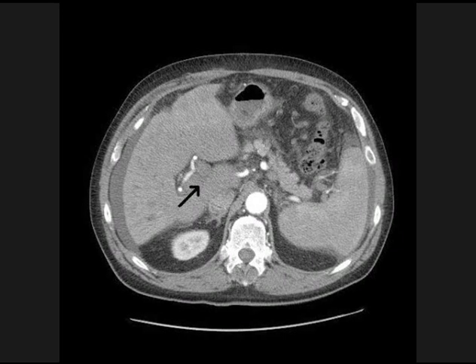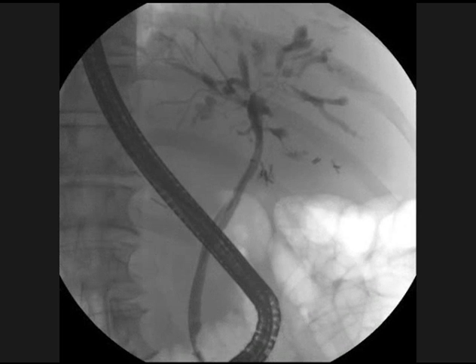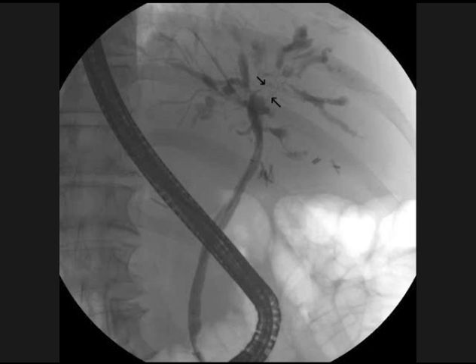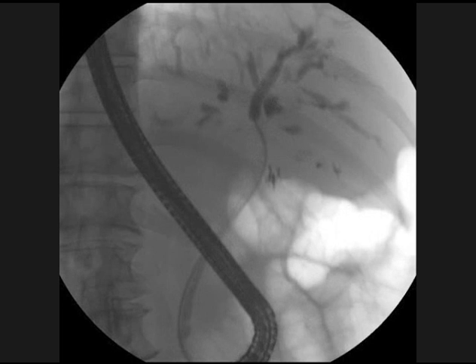Initial cholangiogram showed a normal common hepatic and common bile duct, tight stenosis of the right hepatic duct, and a parallel right-sided duct. There is right-sided intrahepatic ductal dilation and diffuse changes consistent with primary sclerosing cholangitis.